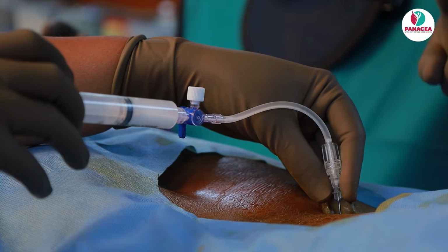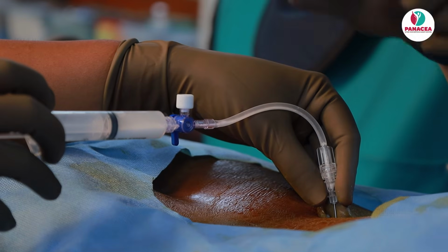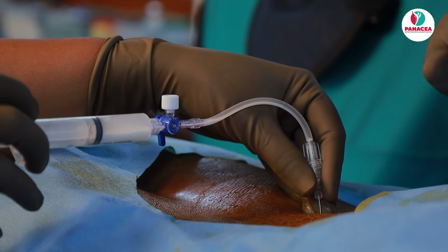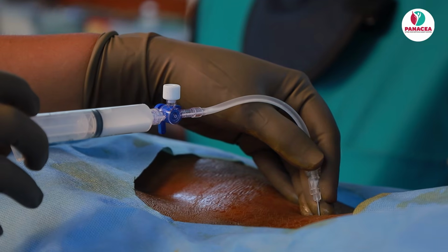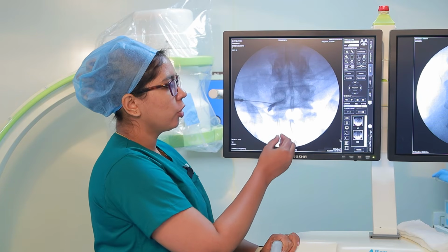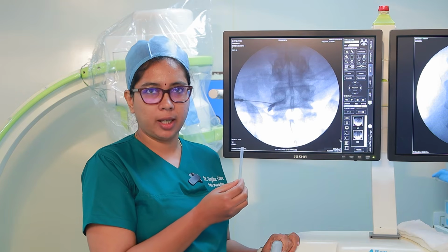So now here, for each level, we inject 2 ml of steroid mixed with a long-acting local anesthetic in the form of ropivacaine or bupivacaine. If it is ropivacaine, it is 0.2%. If it is bupivacaine, it is 0.25%. Needle, it should be subpedicular, just below the 6 o'clock position of the pedicle. It should not go beyond the middle pedicular line.